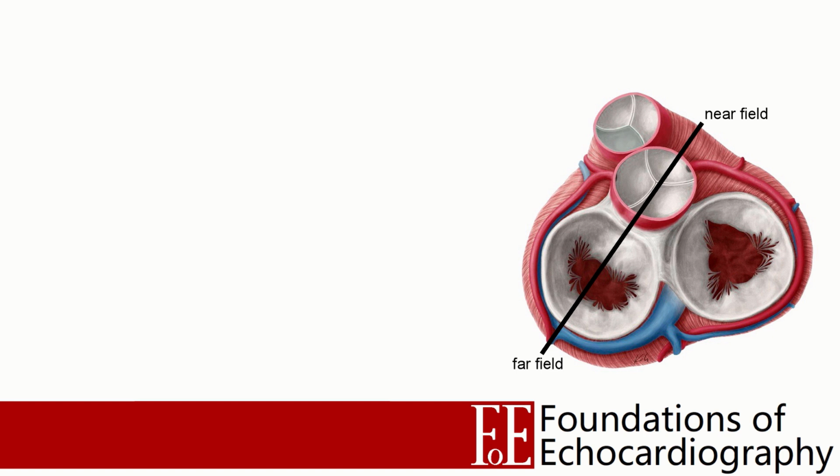So here for the mitral valve, when you're in the parasternal long axis view, take the body of the probe, lower it towards the patient's right hip. Doing so will make your imaging sector move anteriorly towards A1P1. Once you've moved beyond the mitral valve in the anterior direction, lift the body of the probe such that the imaging sector moves posteriorly, down through the centre of the valve, and beyond A3P3.